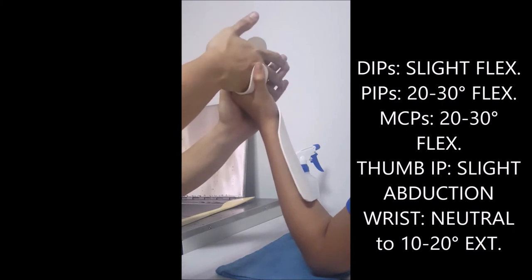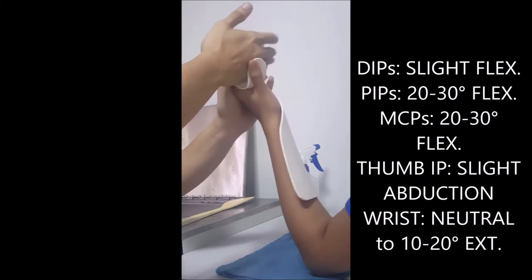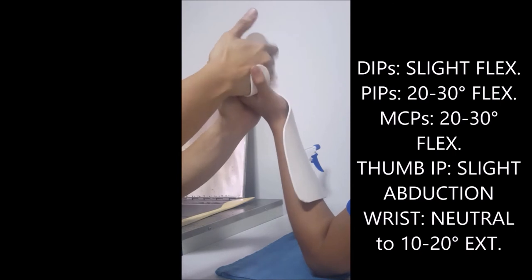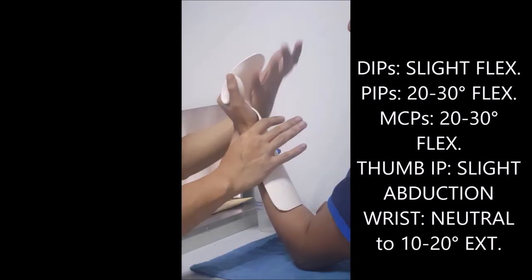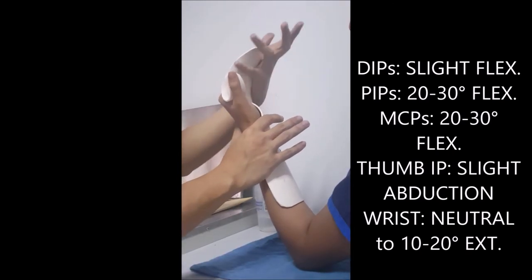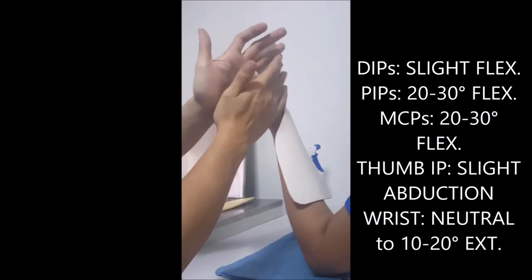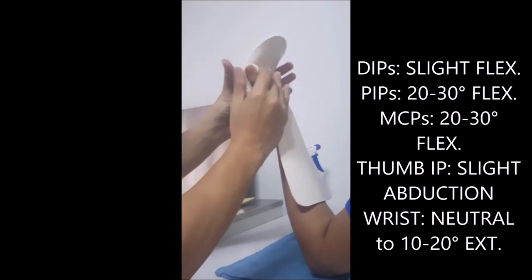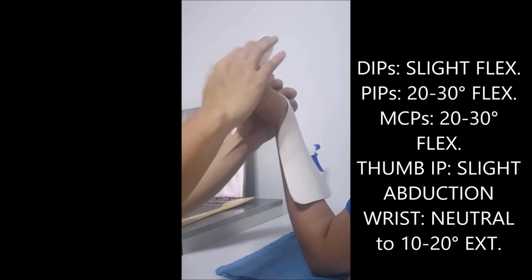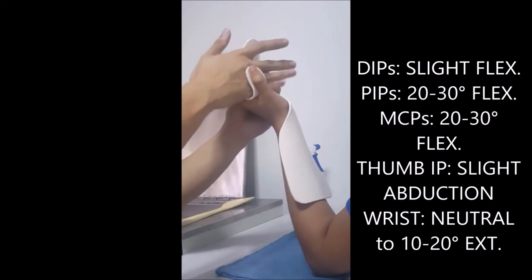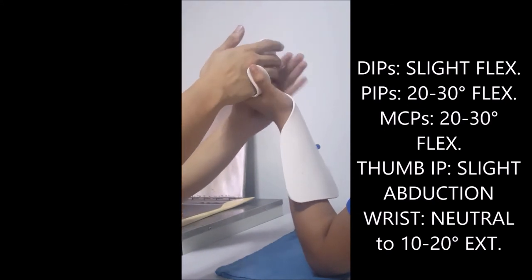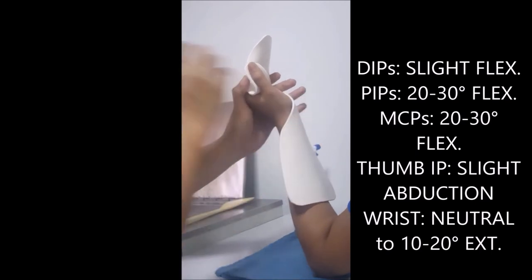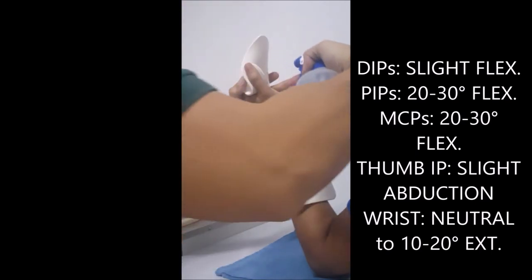Now get the palmar arc and mold the finger pan. Use the ulnar side of your palm to avoid unnecessary marks. Then mold the C bar. Let gravity assist in molding the wrist and forearm. Please be mindful of the position of the wrist when molding the hand. Spray water to hasten the cooling process.